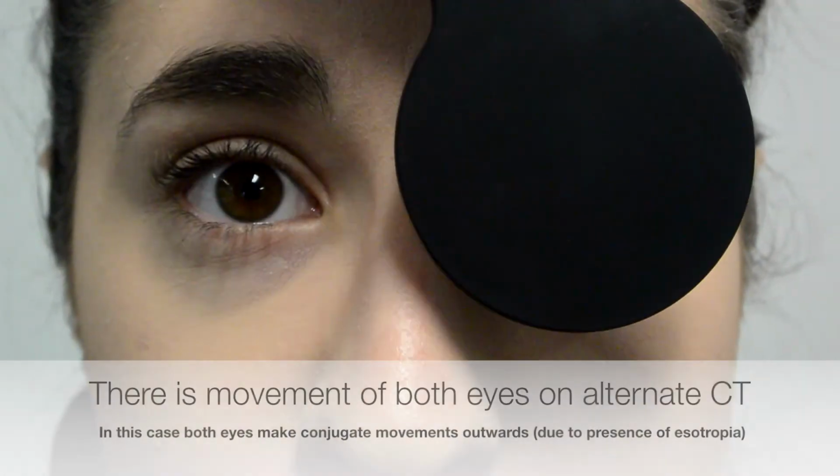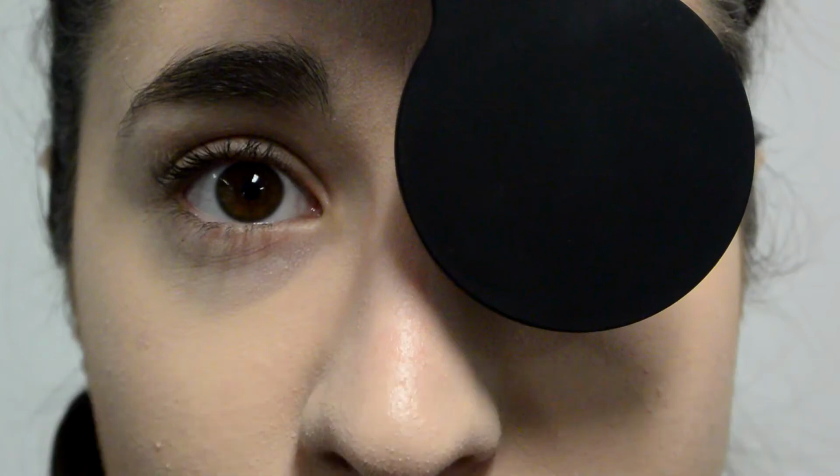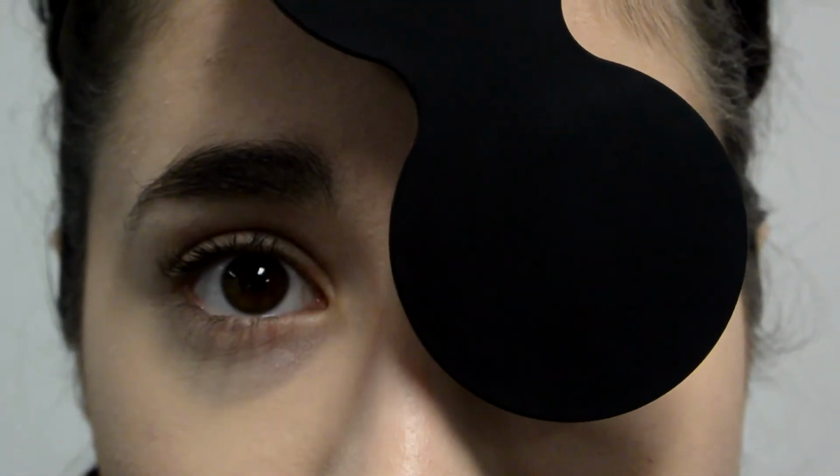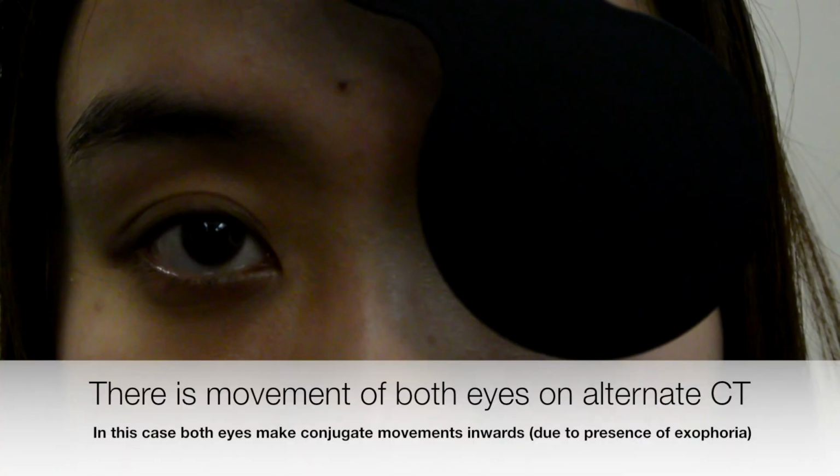A patient who has a manifest deviation will show their maximum deviation size on the alternate component of the cover test. In this case, we see both eyes make outward conjugate movements due to the presence of an esotropia. Once again, the use of the alternate component of the cover test acts to elicit this patient's maximum deviation size. In this case, we see both eyes making conjugate inward movements due to the presence of an exophoria.